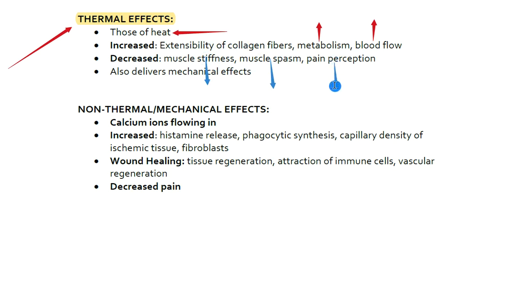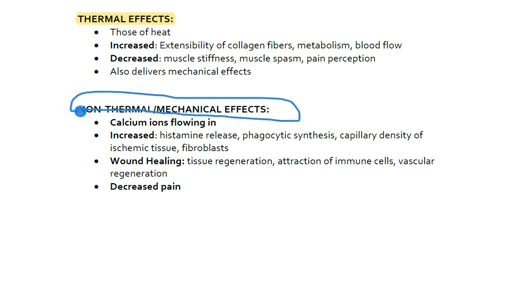Not a significant amount, maybe from a 5 to a 4 or 5 to a 3. And part of that is the gate theory, where the patient feels the heat instead of other things as well. So even though there are these thermal effects, anytime ultrasound is applied, there are also these non-thermal mechanical effects as well.